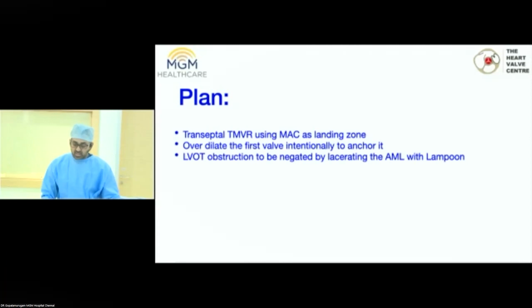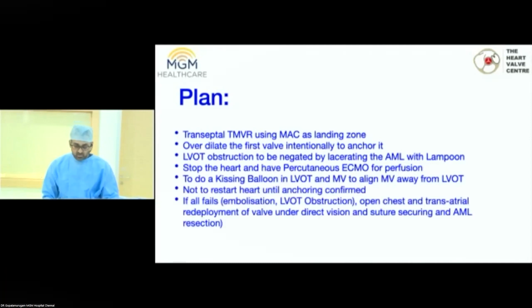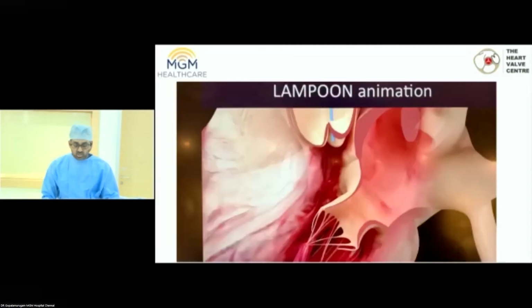We're going to lacerate the AML with lampoon and also have percutaneous ECMO and use a special kissing balloon inflation, which has been described before. We named it KIBAM to try and align the mitral valve away from the LVOT, which I will show in a second. Of course, all this fails. The plan was to do a last resort surgical option.